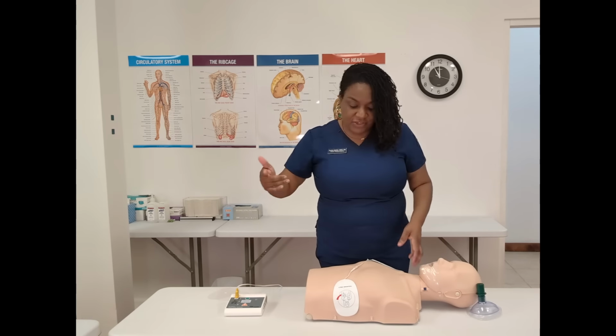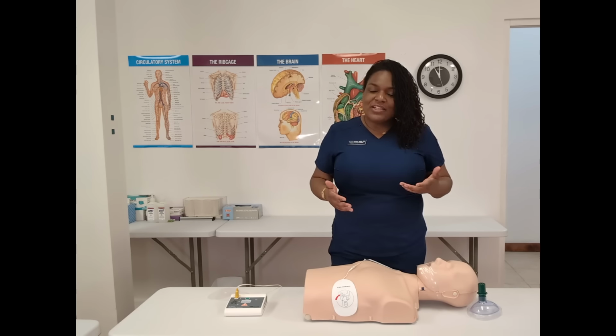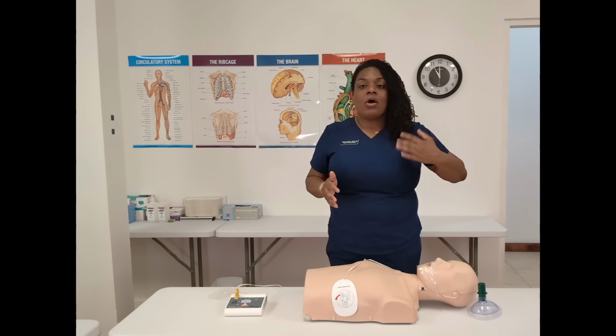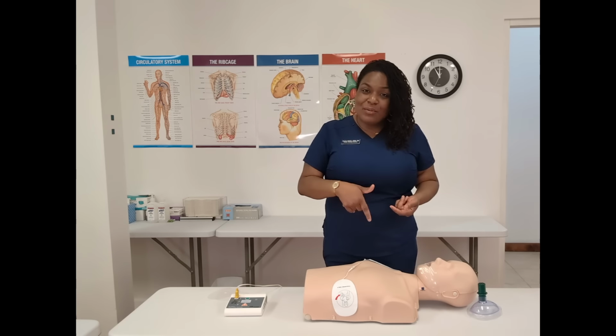All right, everybody, so that was a quick review for CPR and AED for an adult. And children is not much different. A child is from age 1 to puberty. And so if you have a large 10-year-old, if a 10-year-old is adult size, I need you to treat him or her as an adult.